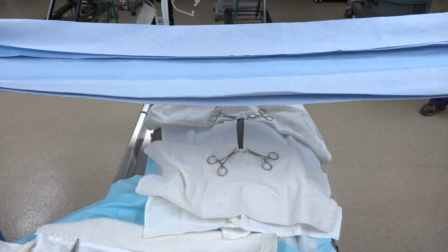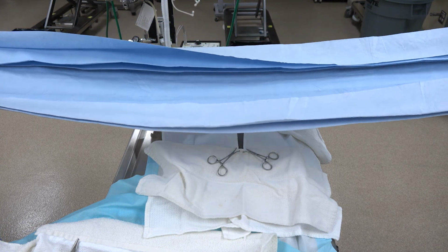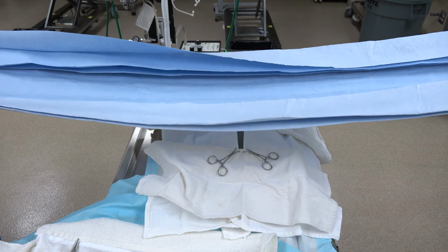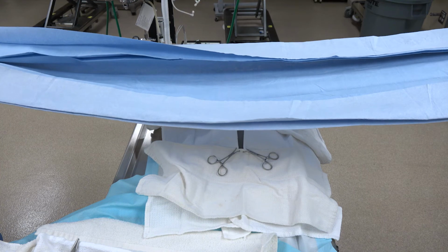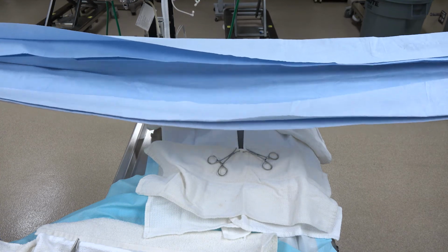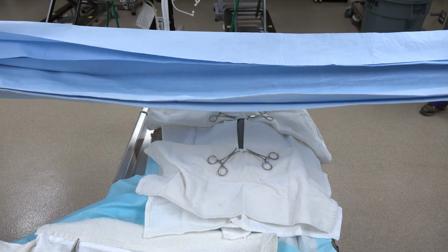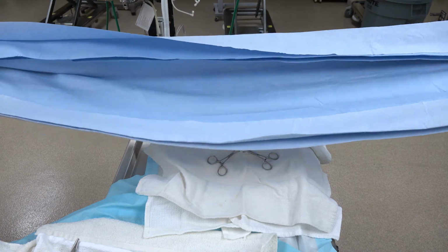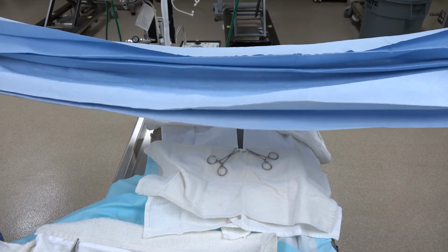So now we're going to take our hands and we are going to hold the corners. Now, here's the important thing. If you take the corners and put your hand on the underside of this drape, your hand becomes dirty. So you have to still keep it up in the air. So it's okay because it's still all folded for us to have our hands, even though this is going to become the underside.